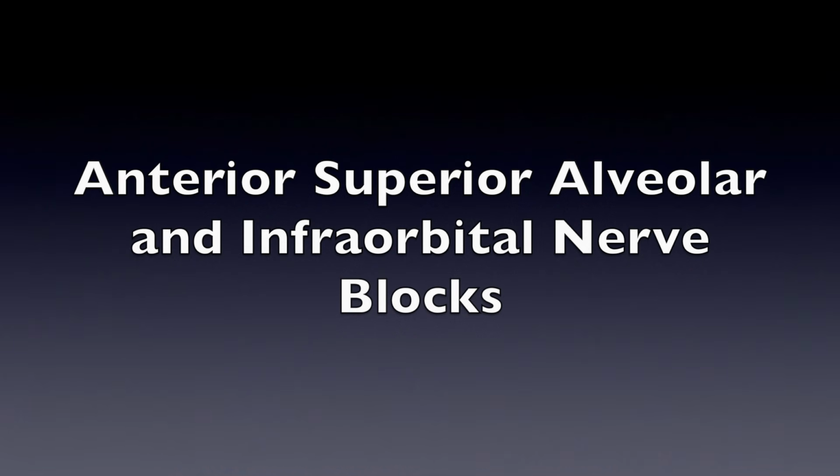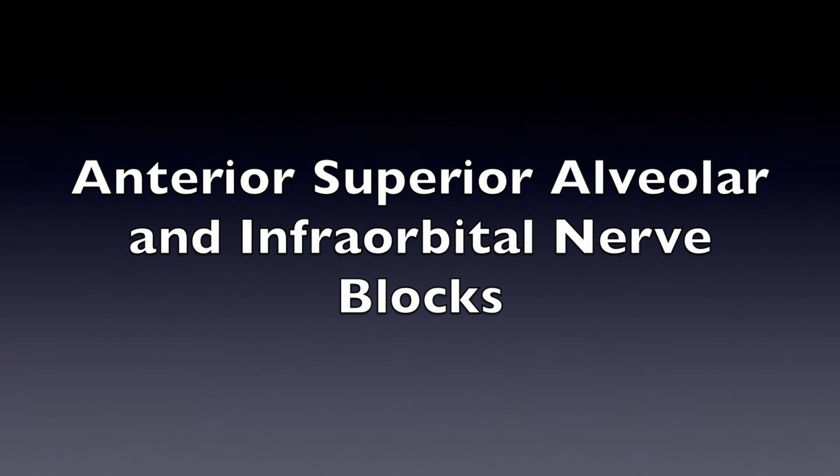Extended verbals for the infraorbital nerve block. Medical history has been reviewed and there are no changes. The vital signs are within normal limits. There are no contraindications for local anesthesia. I will be utilizing 20% benzocaine topical for 1 to 2 minutes and 2% lidocaine with 1 to 100,000 epinephrine with an expiration date of November 2018. I will also be utilizing a 27 gauge short needle.